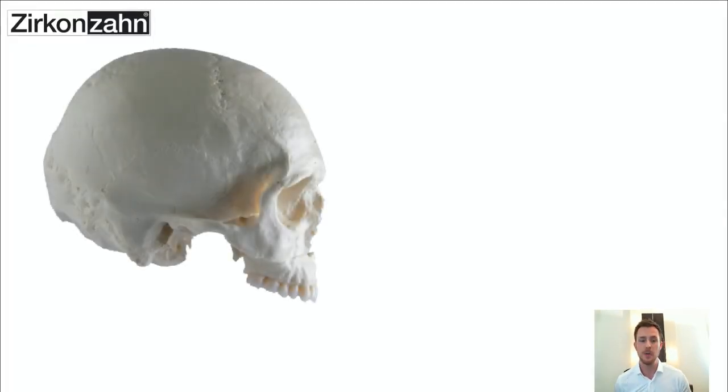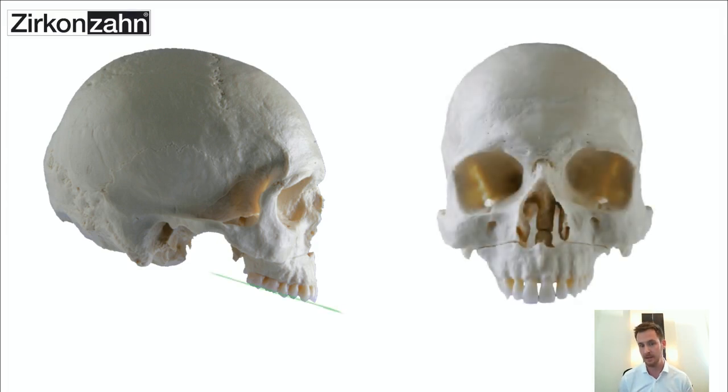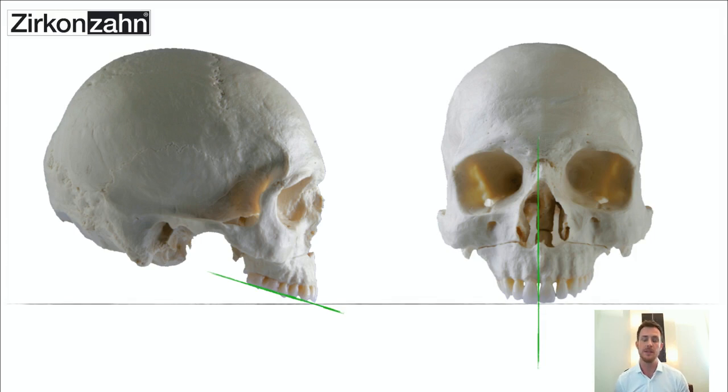And as you know, we have a device called Plane Finder. It's a part of the PlaneSystem to capture all necessary information of the patient. The basic information for us technicians and dentists is really normal to have a certain midline and the occlusion plane information.